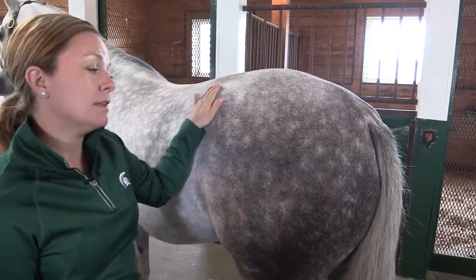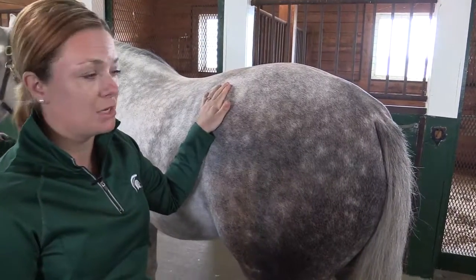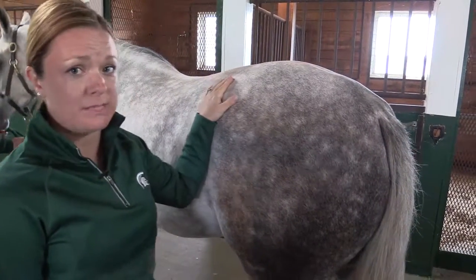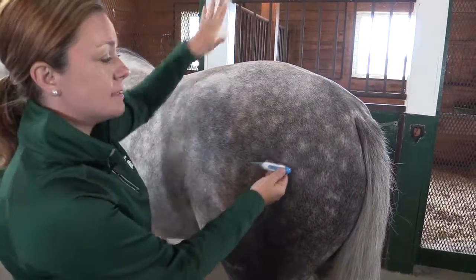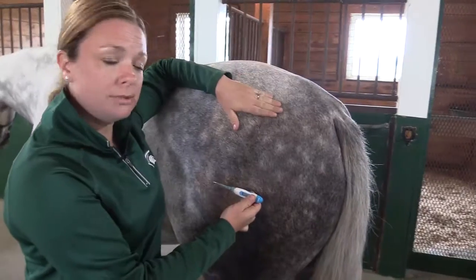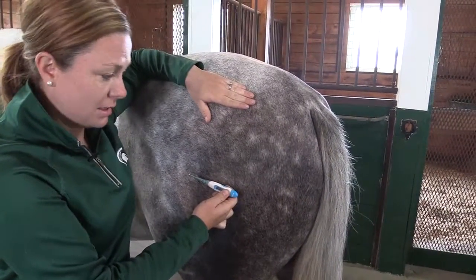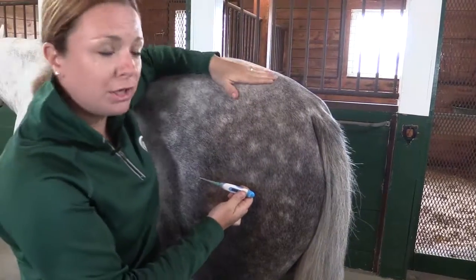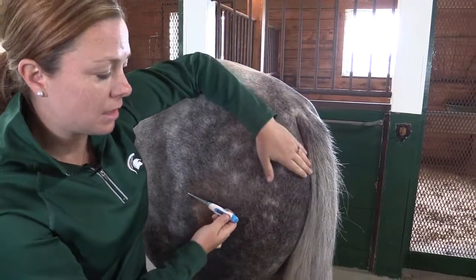It's time to learn about one of the least glamorous vital signs that we can take, but it's extremely important. We're going to talk about taking the horse's rectal temperature. I have a digital thermometer here, and we are going to stand off to the side of the horse. I'm standing close enough to where if the horse did try to kick me, he's not going to be able to get very much done — I'm very close to him, so I feel like I'm in the safety zone. And I'm also standing off to the side.